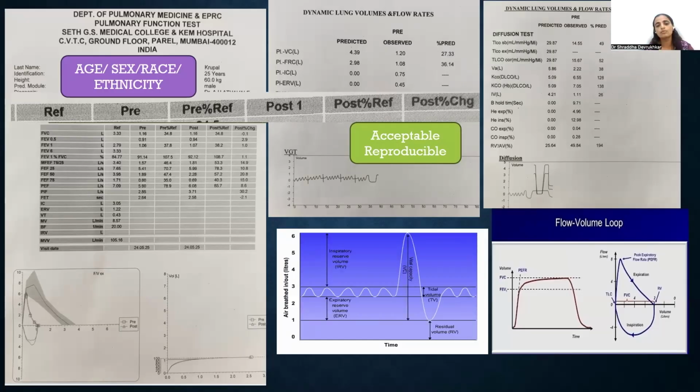Again, the expiratory volume time, if it is less than 1 or 2 seconds, they don't accept it. It should be at least more than 4 seconds. Especially in COPD patients, it can be as long as 10 seconds. So at a glance, looking at the flow volume loop and the expiratory time it requires also gives you an easy diagnosis of what is going wrong.